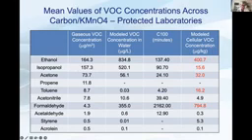When you model that using the algorithms that we just discussed, that actually equates to 520.1 micrograms per liter within the cell culture media. And then that equates to 15.6 micrograms per kilogram within the cellular base itself, or within the embryo. And all of this occurs specific to IPA, from the gaseous mixture to the cell culture media to the embryo itself in 90.7 minutes. And again, this is VOC specific.